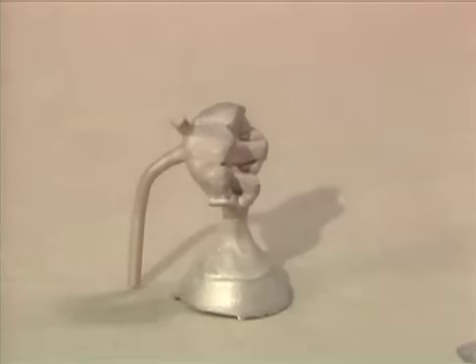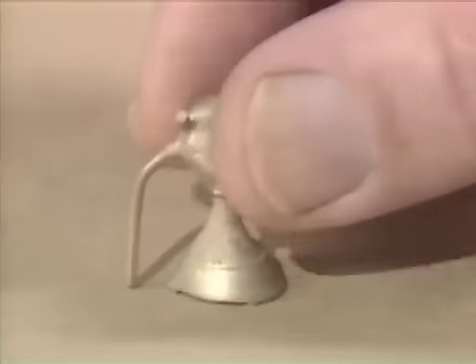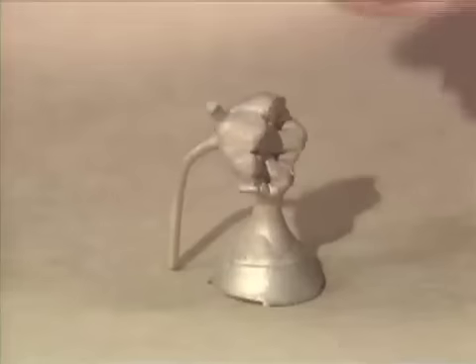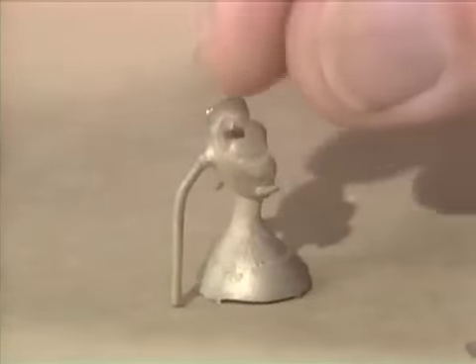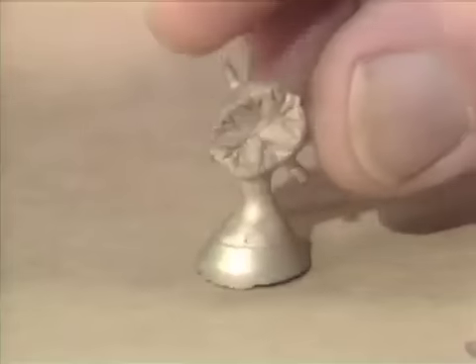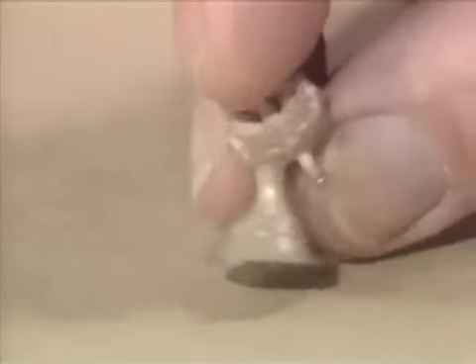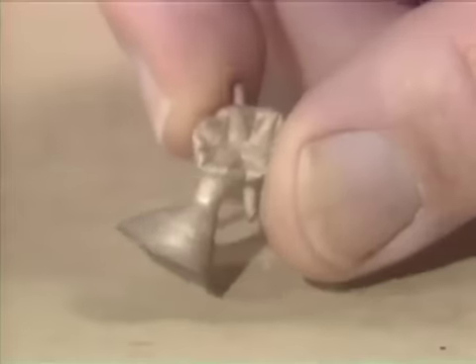You now have the rough casting for the pontic. The sprue is a good-sized sprue. The amount of gold used here was just over nine pennyweights. You can't do this with much less because the pontic is a very large casting and you need a good-sized sprue button to avoid getting shrink-spot porosity.